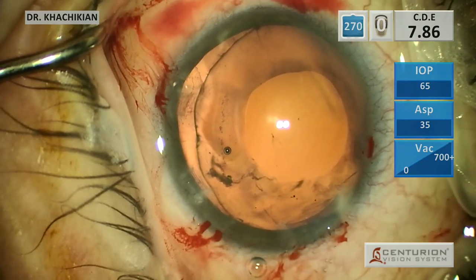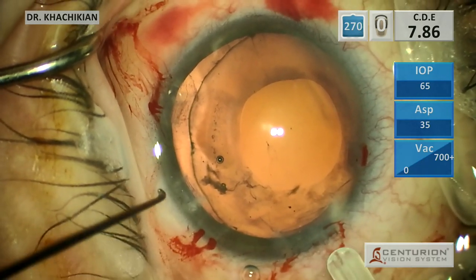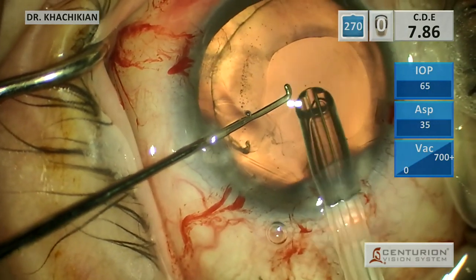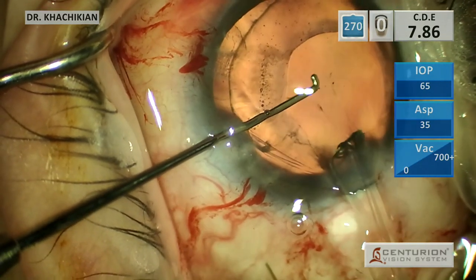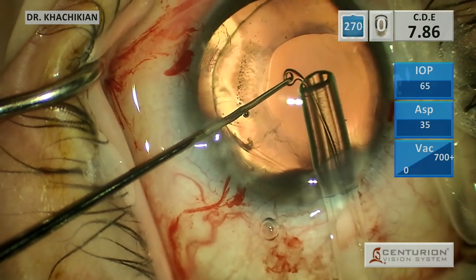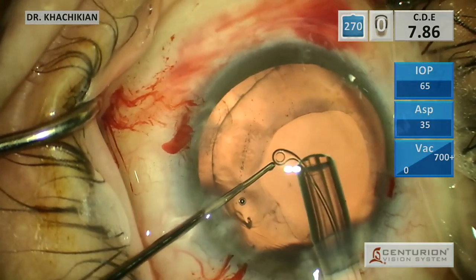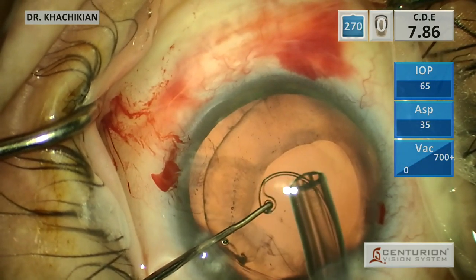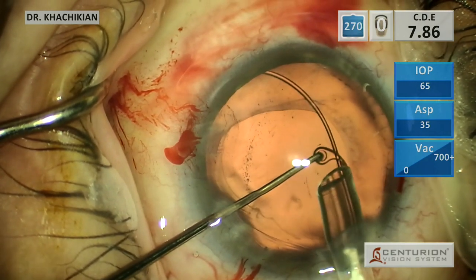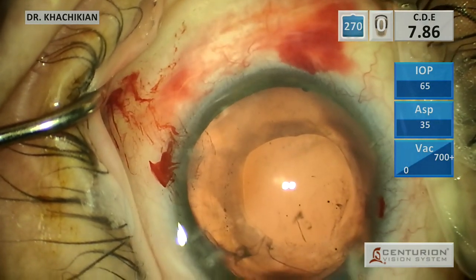Next step is a capsular tension ring. I usually put this in with the assistance of a Sinski hook. The reason for that is I don't like the leading eyelet of that capsular tension ring just shooting into the edge of the capsule - I feel like it's pointier than it should be. So I use a Sinski, and the first thing that touches the fornix of the capsule winds up being a big loop from the hook, which is very blunt and very soft and very gentle. And there we go - boom. That's actually pretty well centered.